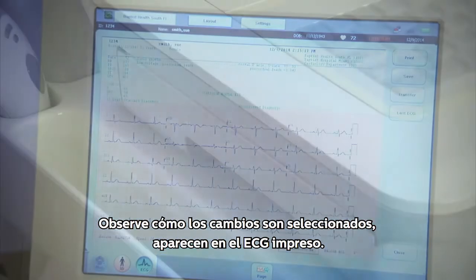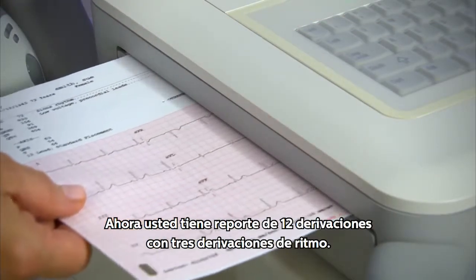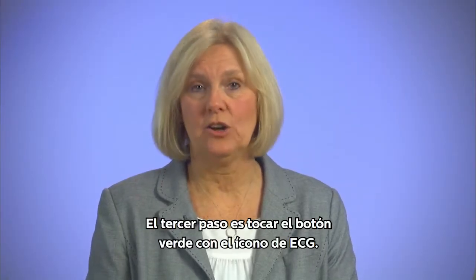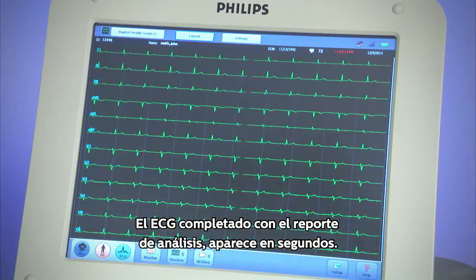This will result in the printed ECG. Now you have your 12-lead with 3 rhythm leads. Step 3 is to touch the green ECG icon. The completed ECG with analysis report appears within seconds.